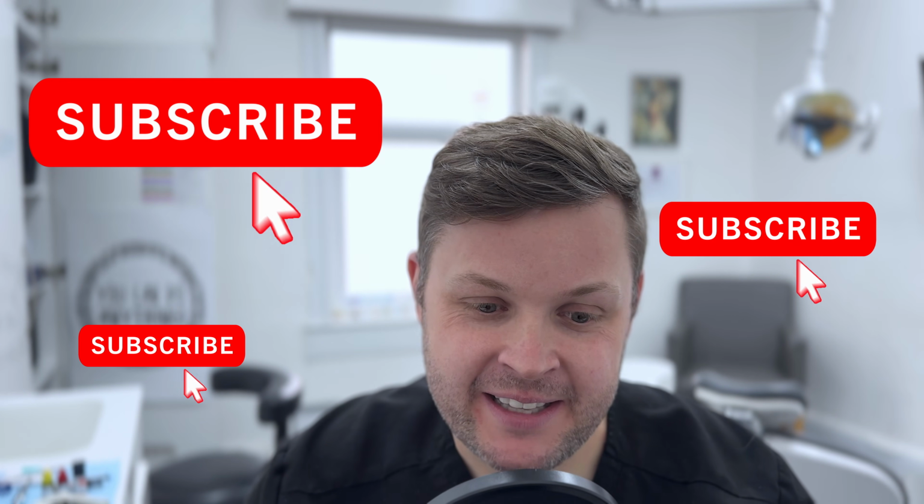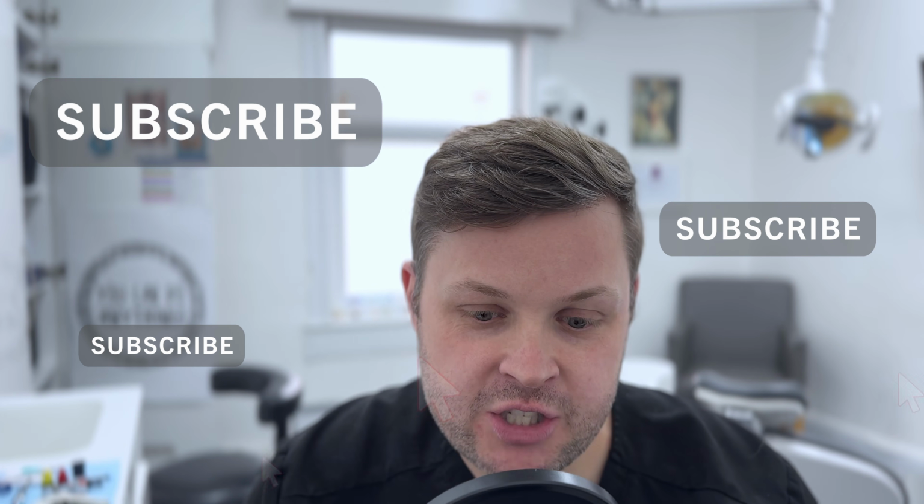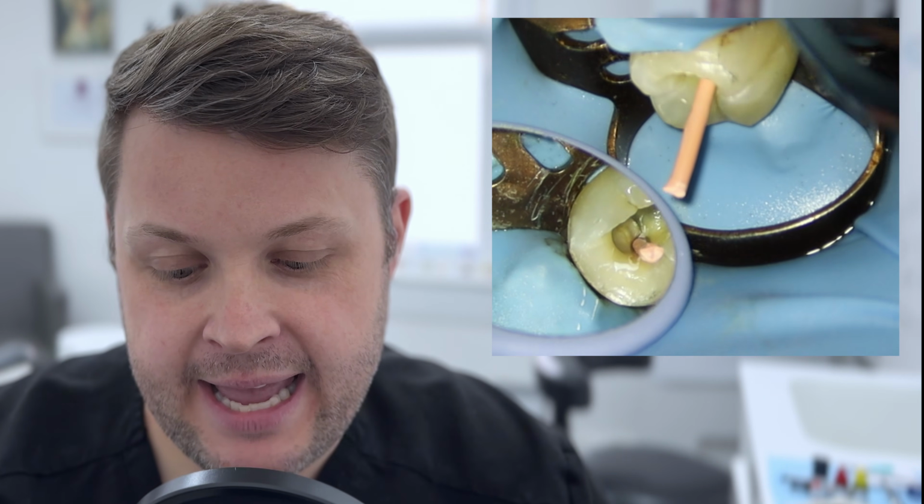Clinical case. This clinical case today is going to center on my obturation technique, and I have changed my obturation technique over the years, and I make tiny little tweaks here and there, and I've made a small tweak quite recently on how I place my sealer within the canal while we're doing obturation. But of course, all of these Friday clinical cases showcase a full root canal from start to finish.